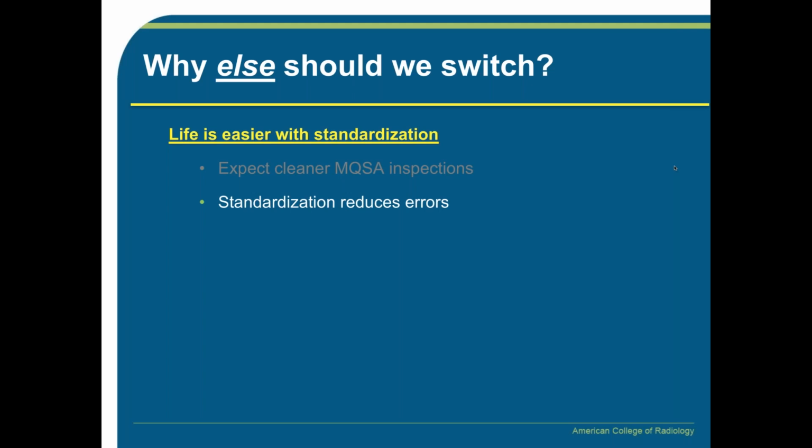Standardization reduces errors, so if you only have to know one QC program with one manual and everybody works from that, it can reduce errors. There's no question about that. There's no more chasing manufacturer QC manuals and different versions, because we all know that every time something comes out, oftentimes there's another version that has to be followed.